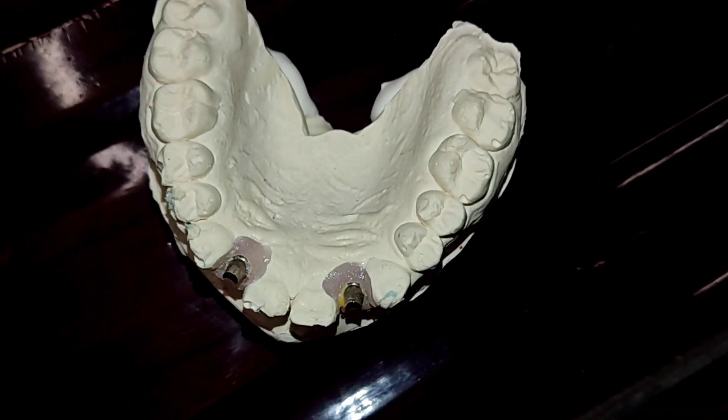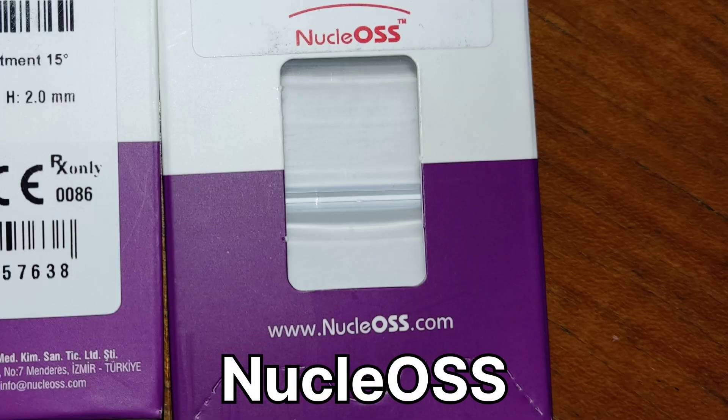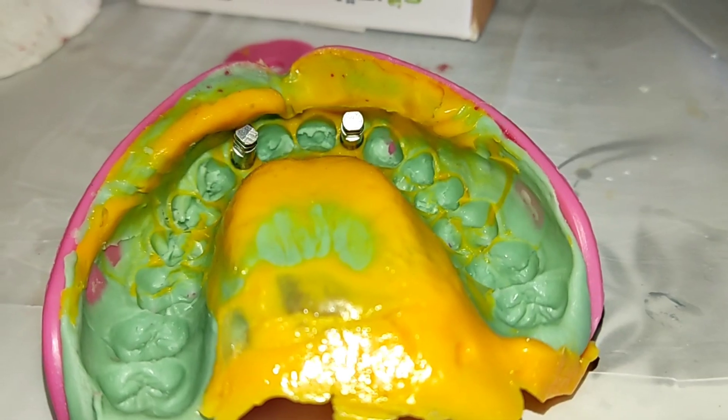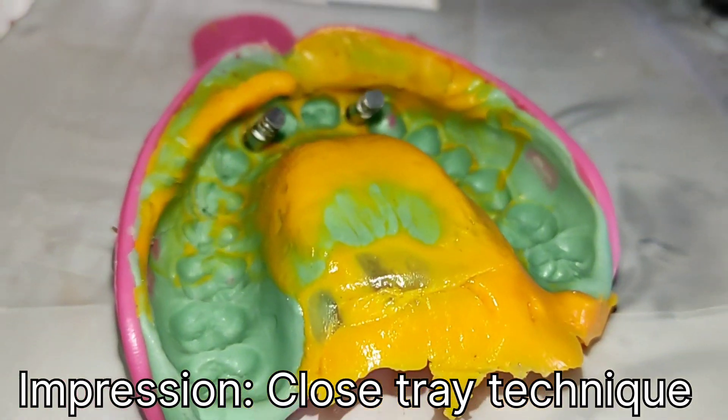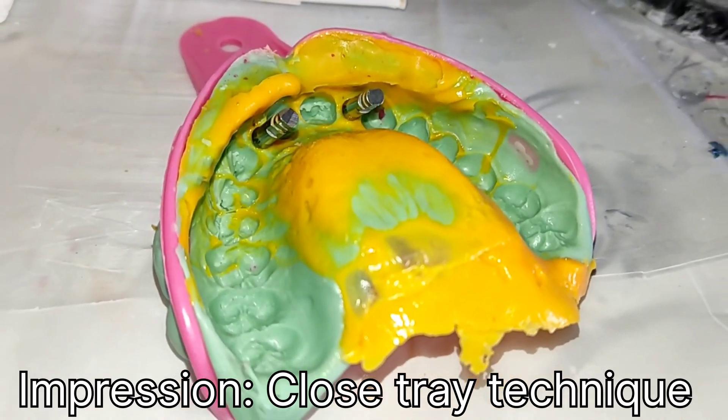Nucle OSS is an implant manufacturer founded in Turkey in 2001. It offers a range of 9 bone level and tissue level implants with tapered, straight and tapered apex shapes, distributed in over 16 countries.